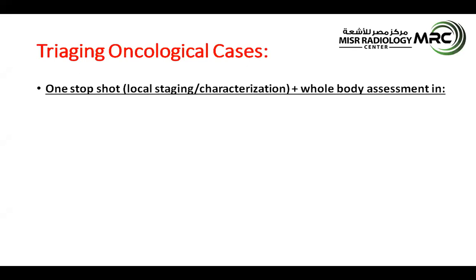We found out that the most influenced cases, or the cases where we found PET MRI to have an edge in, include, of course, the breast, because MRI helps in the detection of multicentricity of different breast lesions. And lobular carcinoma is one of the tumors which have variable affinity to FDG.